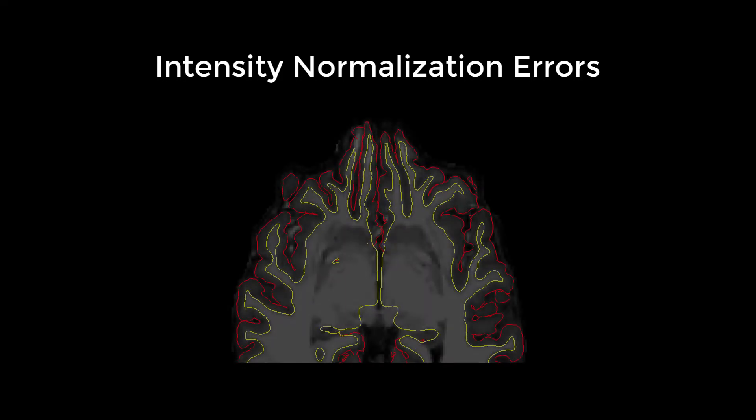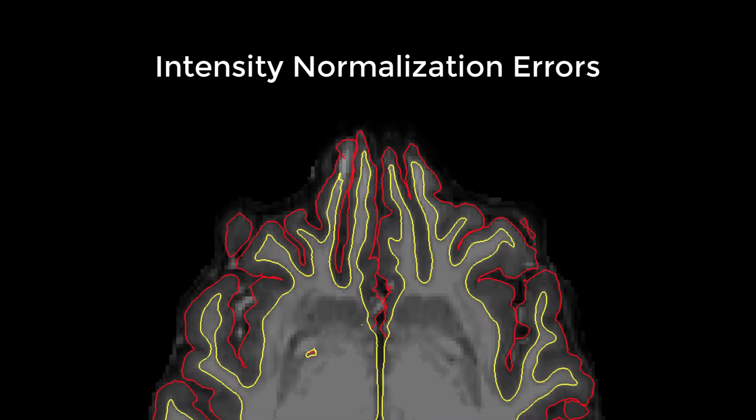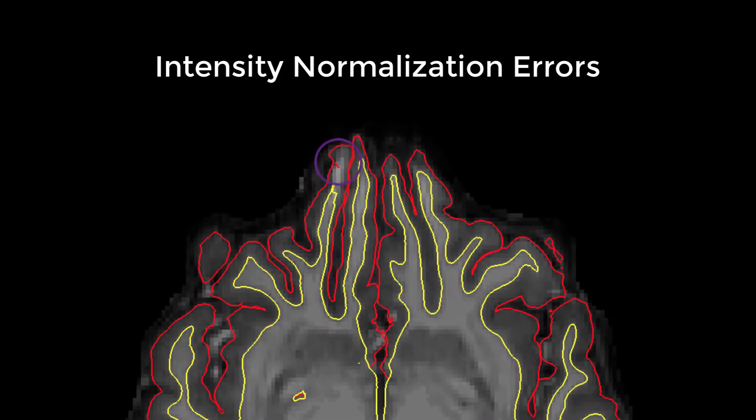Another common class of errors are intensity normalization errors. Usually in this case, white matter is incorrectly labeled as gray matter. This happens most frequently in the ventral temporal lobes and the orbital frontal areas.